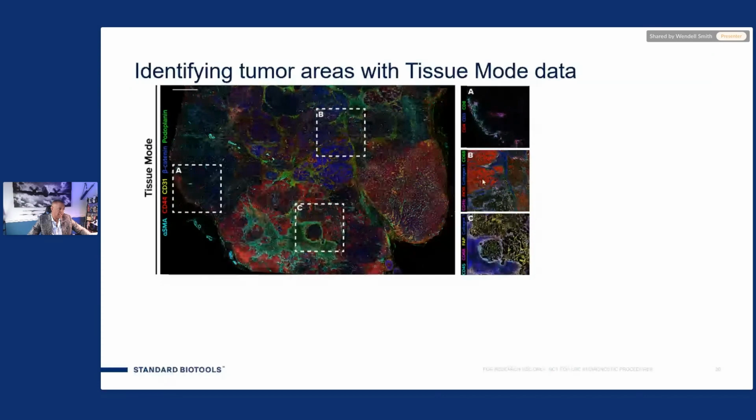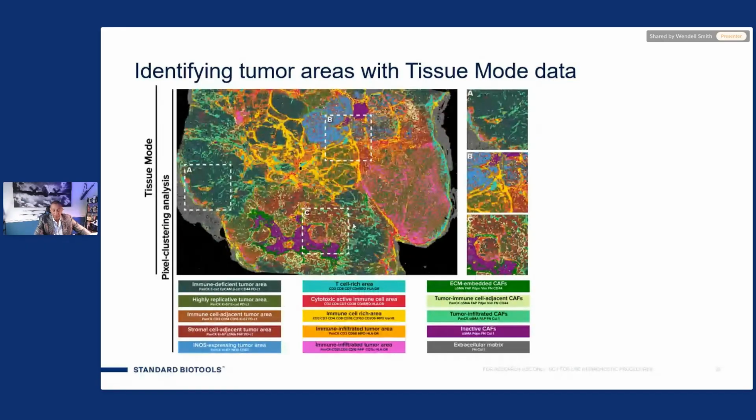So if we're looking at CD68, for instance, or we're looking at inflammation with iNOS, we're still able to find that. Our hematopoietic cells, all of this is not lost information at this resolution. Now, because it's at 5 microns and not 1 micron, we understand that traditional methods of segmentation may not be approachable here.